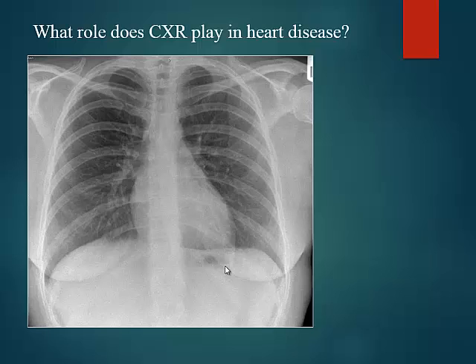Yeah. Patients with chest pain, the chest X-ray. So chest pain, which chest pain? Any chest pain, generally, you probably want to do a chest X-ray as a baseline. Yeah. So you could do a chest X-ray as a baseline, and chest X-ray can be used to exclude certain things. It may not give you a diagnosis of chest pain, but it may be helpful. Okay, so anything else?